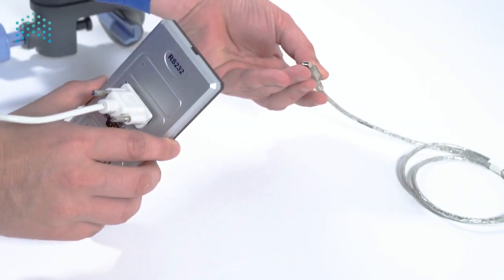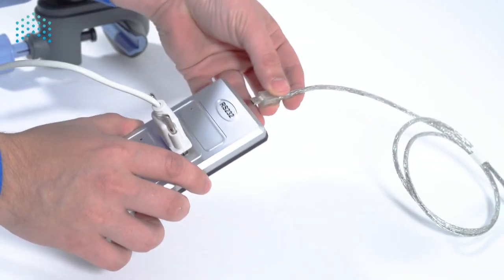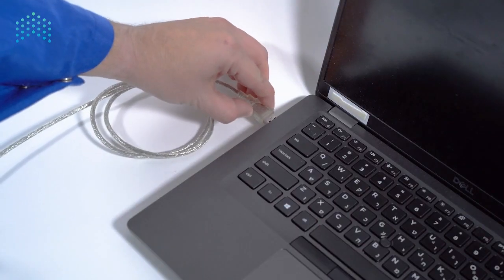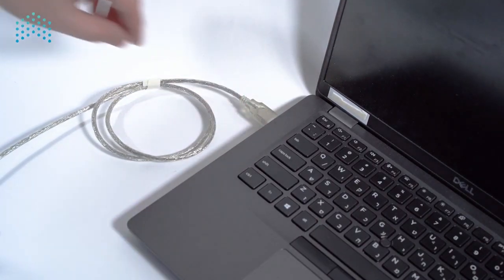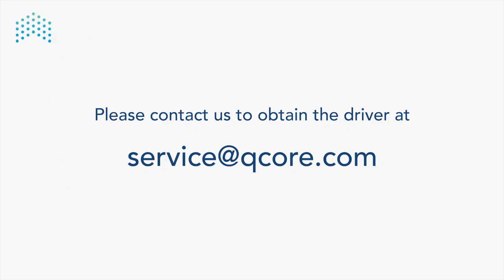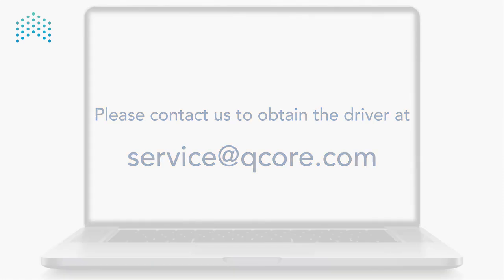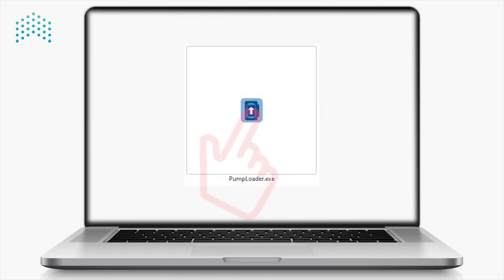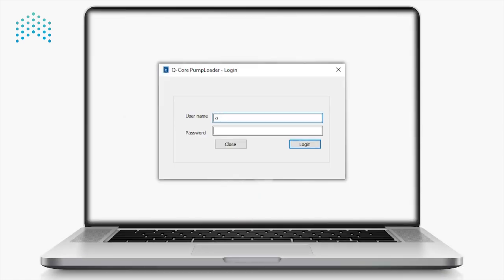Note that some operating systems will require you to download the driver for the USB port. Please contact us to obtain the driver at service@qcore.com. Open the pump loader and type in your PC Tools credentials in the Login window.